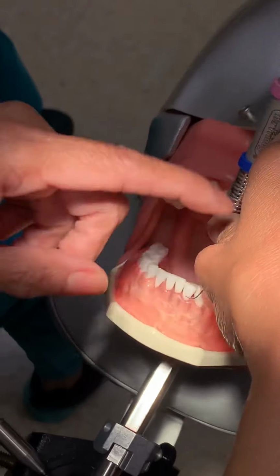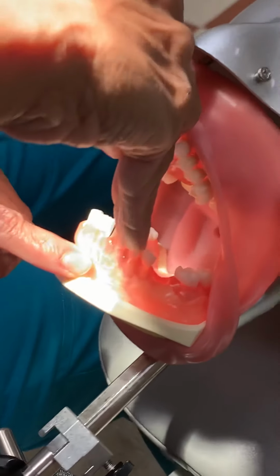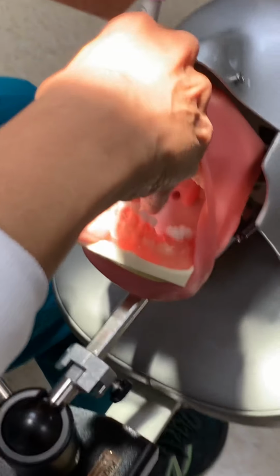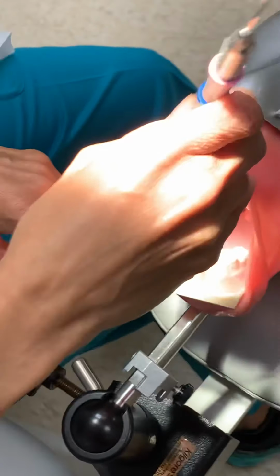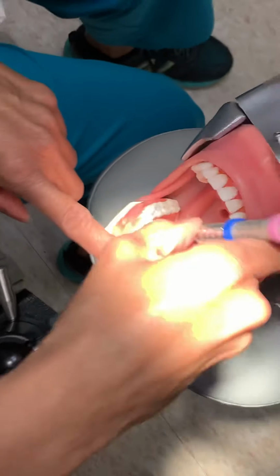See how I'm kind of up on my fulcrum? My fulcrum is not lazy like this. I'm standing up on my fulcrum. Get ready zone, tip third. I'm using my wrist rocking motion. It's kind of like opening a doorknob. That's your wrist rocking motion. So if any of you are having a problem with the wrist rocking motion, like Ms. Room told you yesterday, just sit on your fulcrum and just rock like this. Just go up to the doorknob and rock like that, as if you open the doorknob.